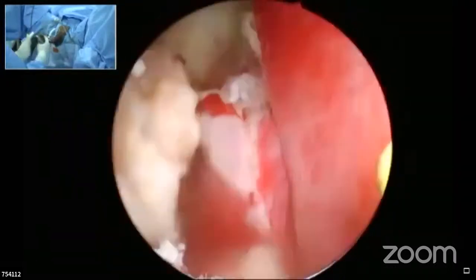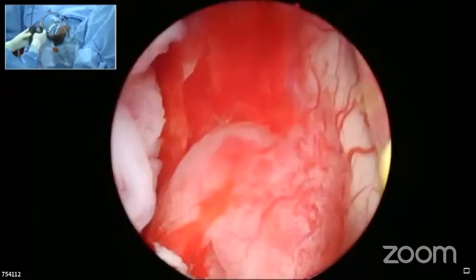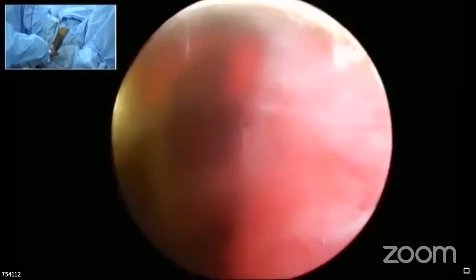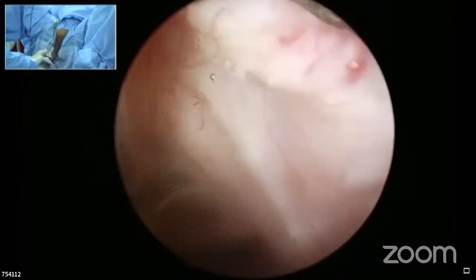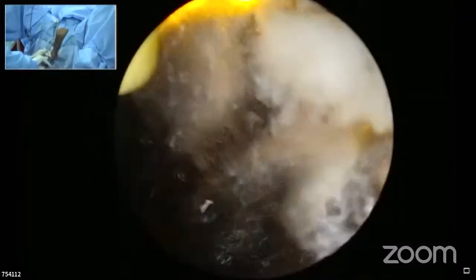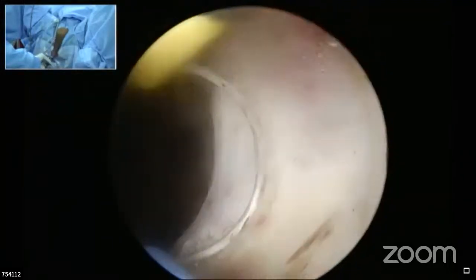Whenever the injury in the capsule is like this, what we saw, which doesn't bleed, in a bipolar TURP, I think you can go ahead with a resection because the chance of extravasation and TUR syndrome, or intravasation rather, I would say, is negligible in a bipolar TURP.